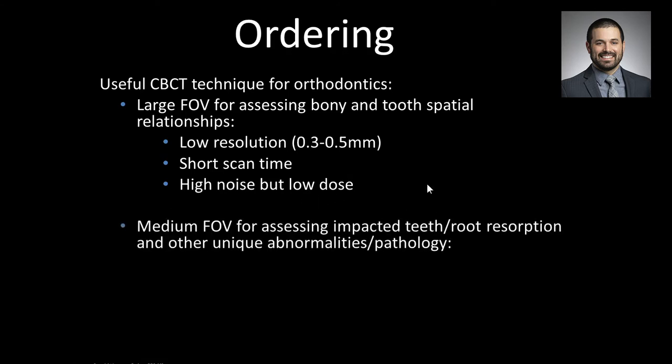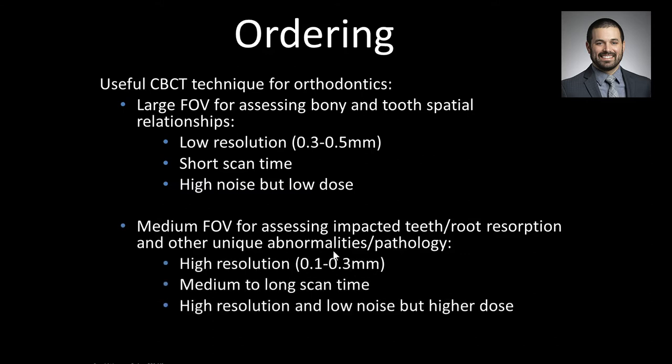The second approach in orthodontics is a more focused and detailed approach where you select a medium field of view with higher detail, and that would be, say, if you have an impacted tooth or suspected root resorption or another unique abnormality or possible pathology. We go down to a higher resolution, 0.1 to 0.3 millimeters, with a medium to long scan time. We get a higher resolution and lower noise, but at the expense of a higher dose. And of course, with this focused approach, you're trying to address a very specific clinical or dental condition or situation with detail.